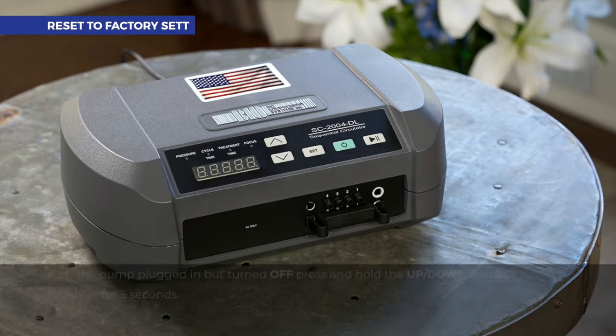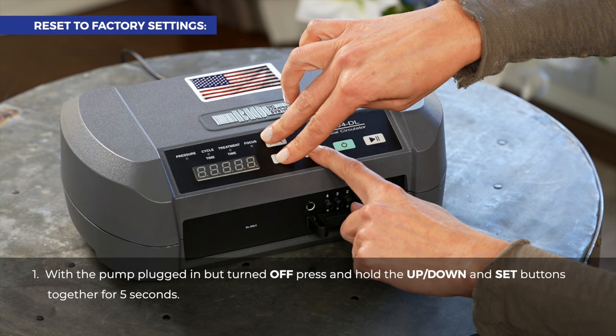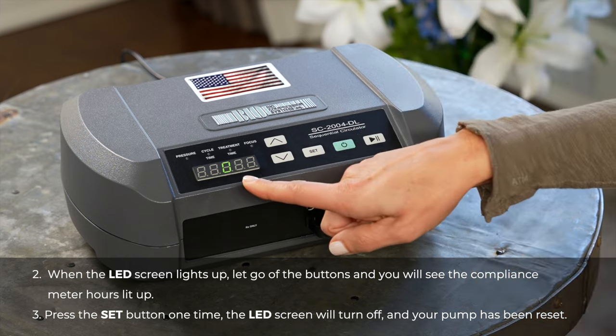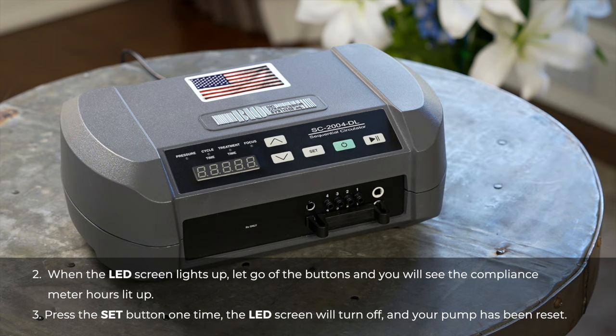If you need to reset your pump back to factory settings, with the pump plugged in but turned off, press and hold the up, down, and set buttons together for 5 seconds. When the LED screen lights up, let go of the buttons and you will see the compliance meter hours lit up. Press the set button one time, the LED screen will turn off and your pump has been reset.